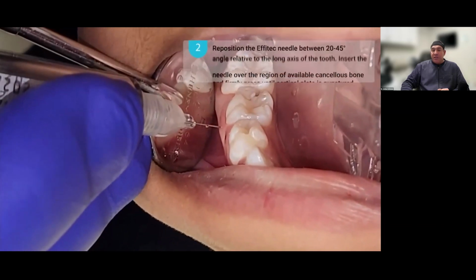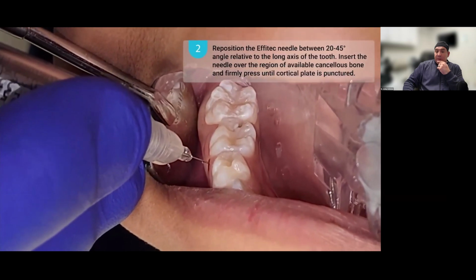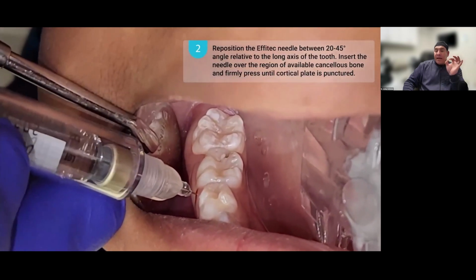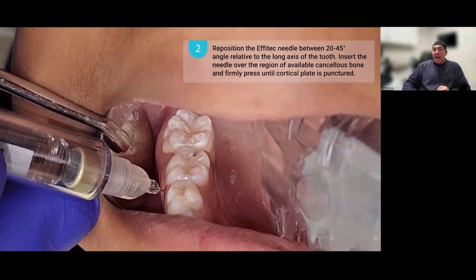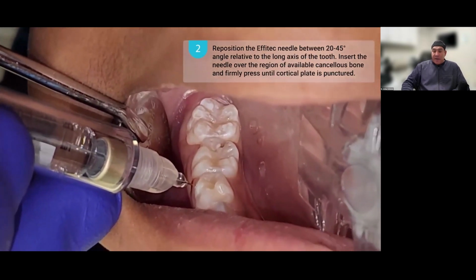Now we're going to switch our positions. I want you to observe how he's holding the syringe at this point. He's right close to the hub. We're going to push, and there we go. That little resistance, that's our manual bone penetration. We're switching the pedal now, and now we're on the large pedal. And at this point, we're delivering our local anesthetic.